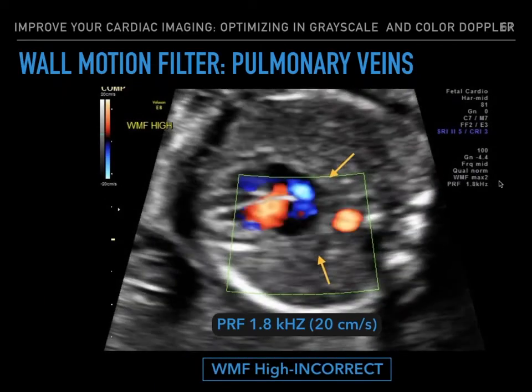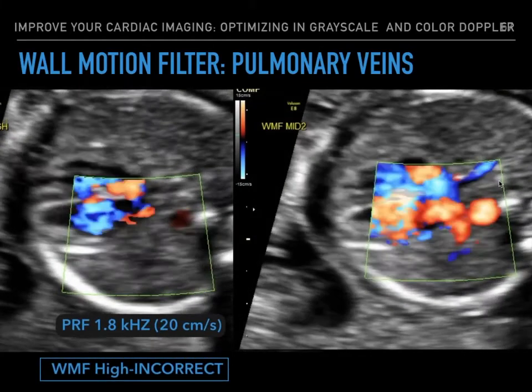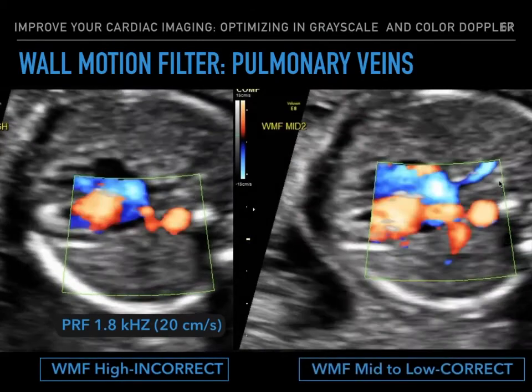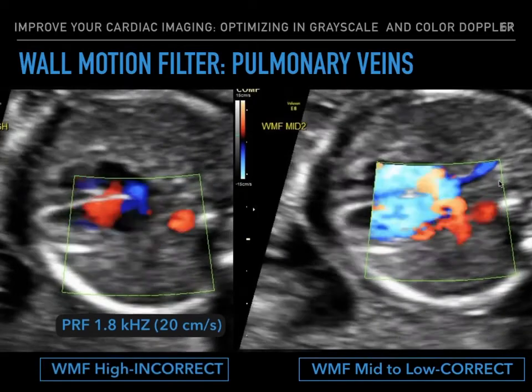So utilizing a mid to low wall motion filter setting is actually appropriate to evaluating the pulmonary veins. And here you can see the pulmonary veins draining in nicely into the left atrium.